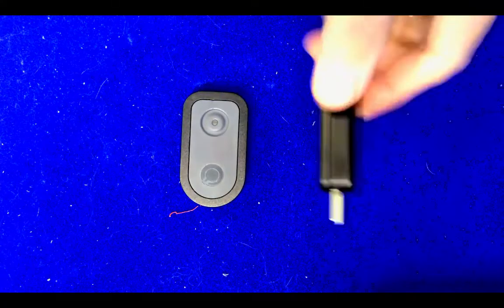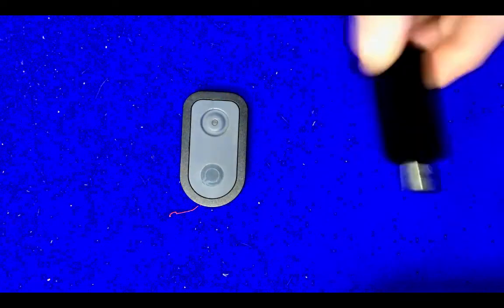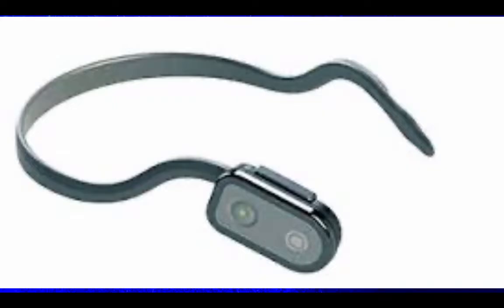These are the two parts up close. This is the receiver that plugs into your computer or device. It provides accurate computer access with just small head or body movements.